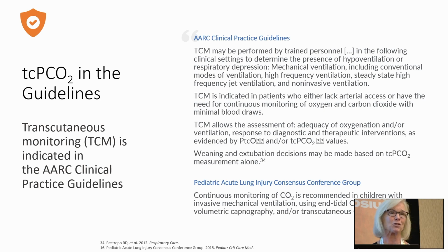Or how many times do you guess the ventilator settings? Okay, I think this patient's going to need this, and you get that first blood gas back, and you're all excited because you get it right. So our clinical assessment is really good, and we are good judges of what a patient's CO2 is.